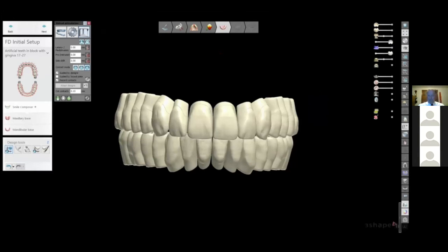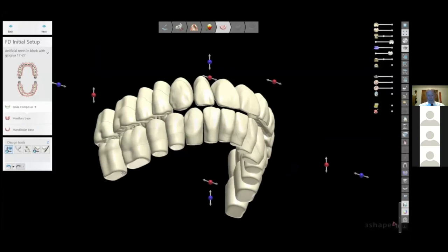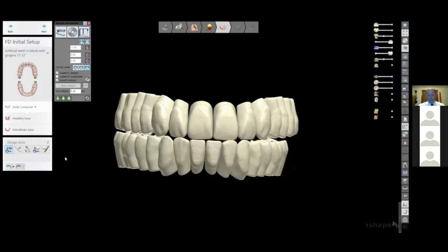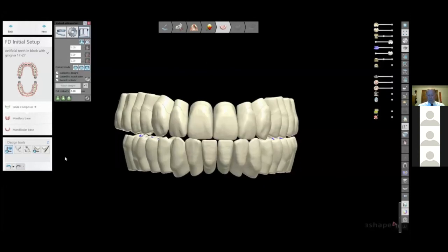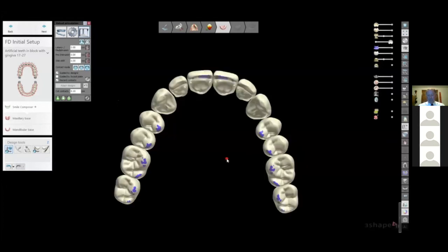This is the Ivotion Phonares 2 ortholingual. Fantastic. Look at this. You wouldn't know this is lingualized occlusion until you flip it up and you see the space between the buccals of the teeth. And let's put this to the test of excursion. I did no equilibration. This is how these teeth are set. And our protrusion, and let's take a look at the contacts.